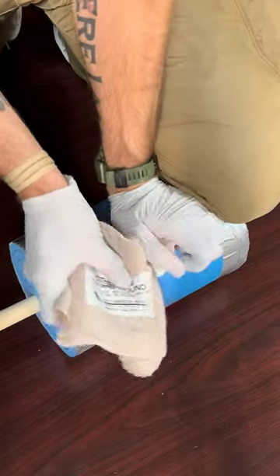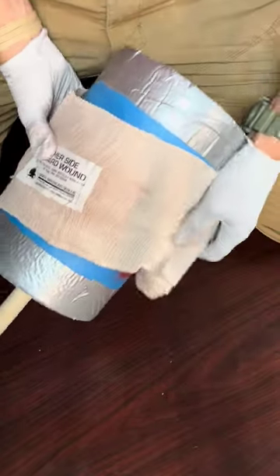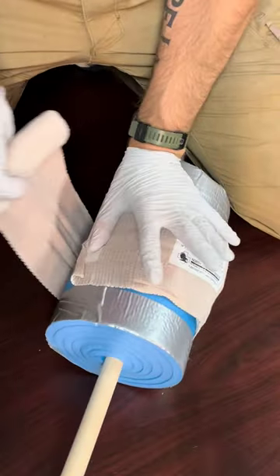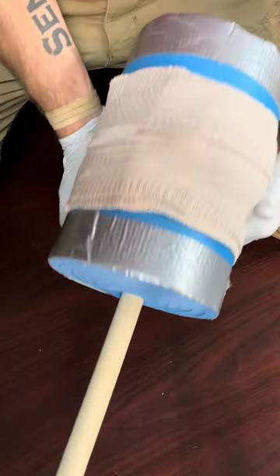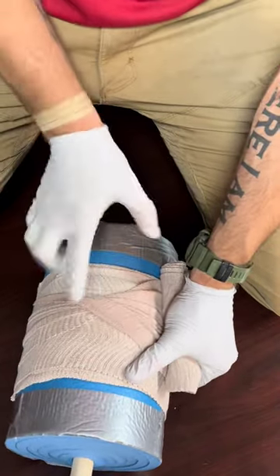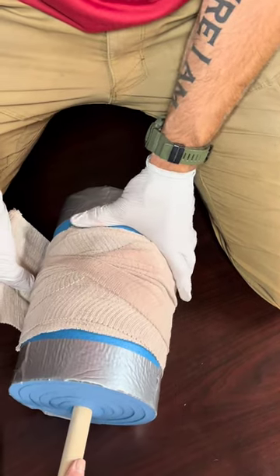Take your trauma bandage with the gauze pad facing down, put it over top of your gauze that's packed in the wound, then wrap it around. The first wrap applies friction and holds the entire system in place. On the second wrap, you're going to pull tight and twist with the twisted section going right over the gauze, applying more pressure.